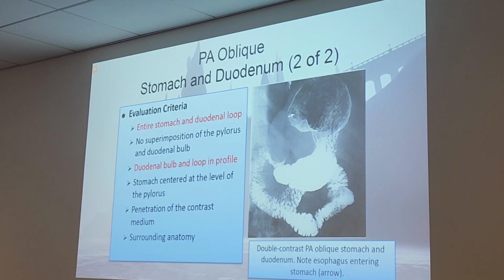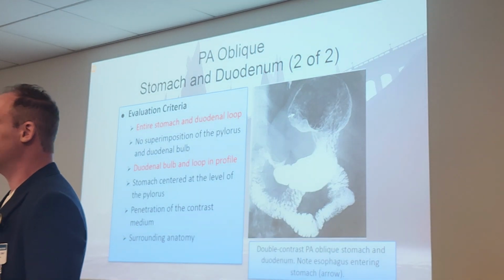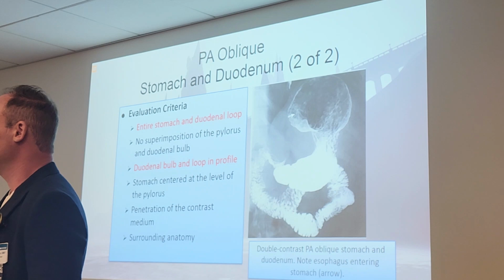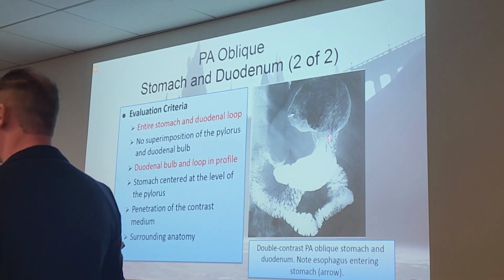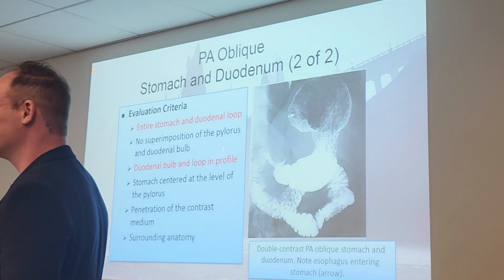Okay, so what are we looking at? Entire stomach and the loop. And of course, like I said on the previous slide, guys, we're still doing this primarily for the bulb and the loop placed in profile. Bulb and loop in profile, which is what you see right here. And they still cut it all off. It kind of looks like an atomic bomb, doesn't it? It looks like a mushroom cloud.